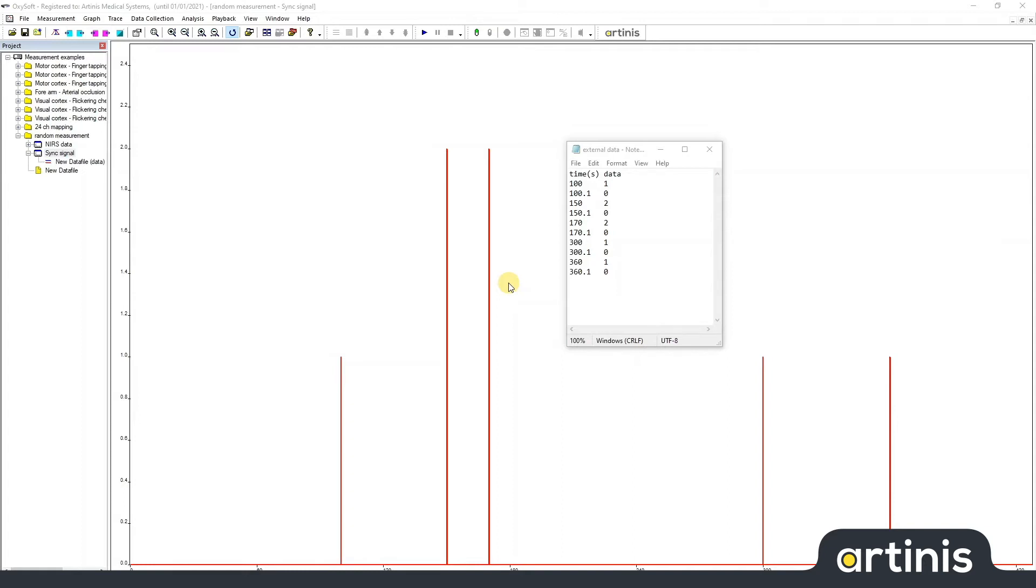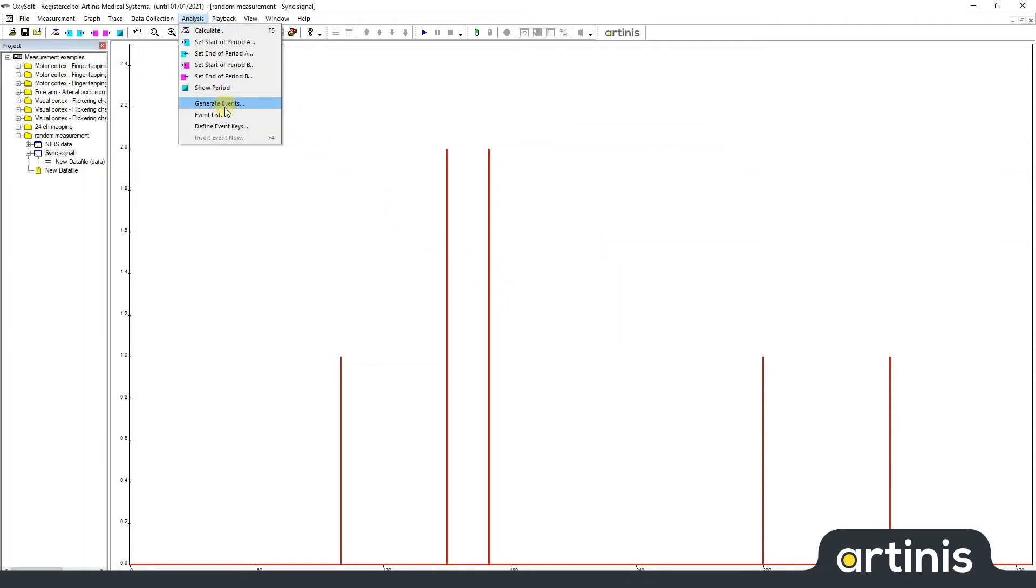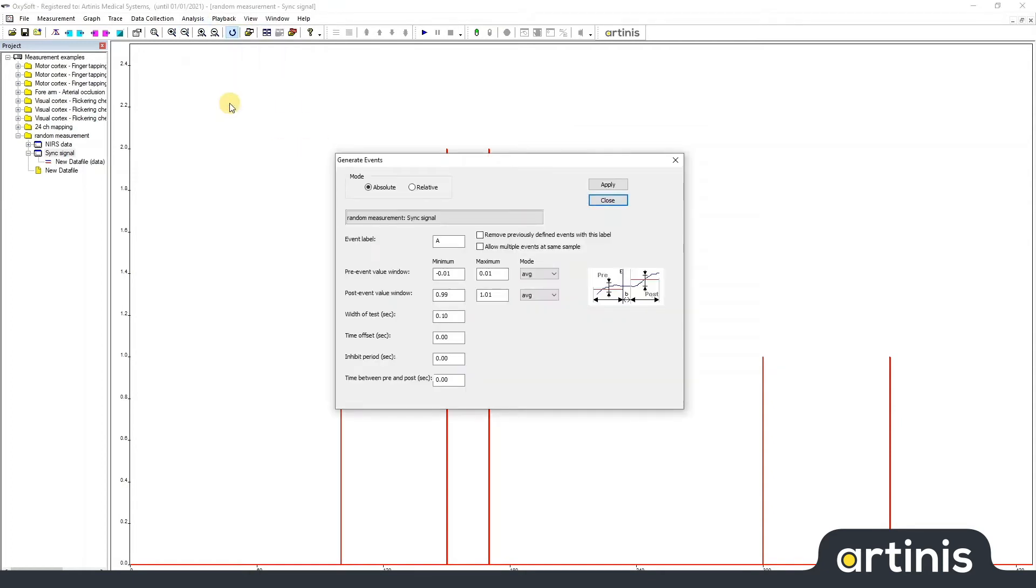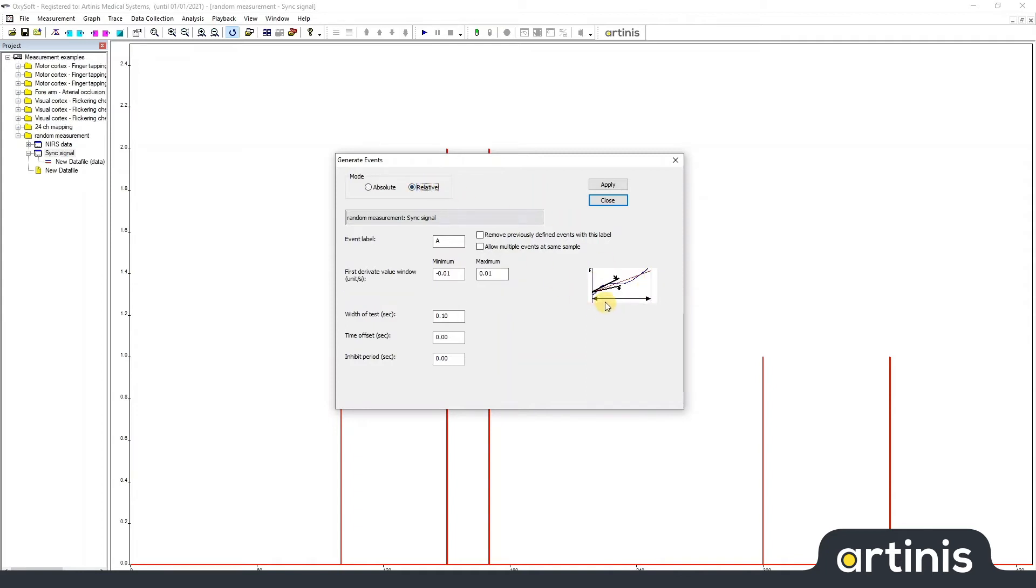To automatically detect these events we go to analysis, generate events. There are two ways to do this. One is the absolute where you compare a value before and after the possible event, or relative where you find a certain slope to be labeled with an event. In this example I will use the absolute way.